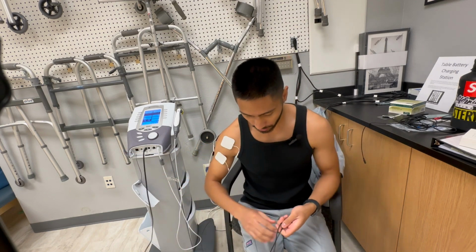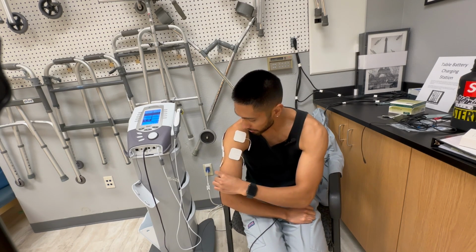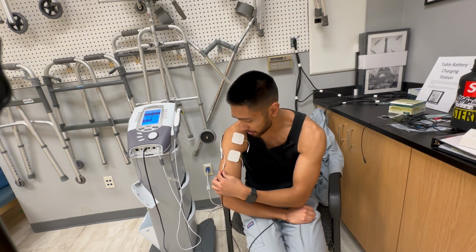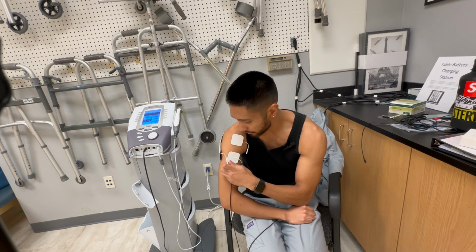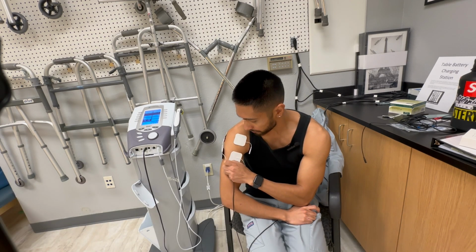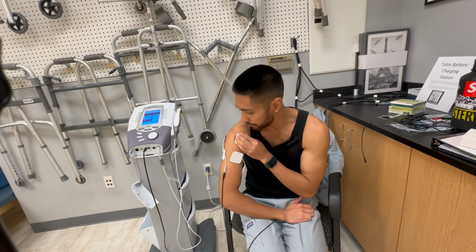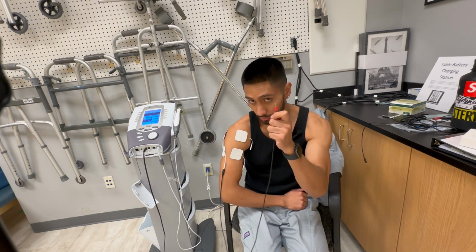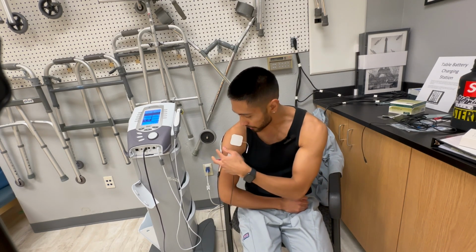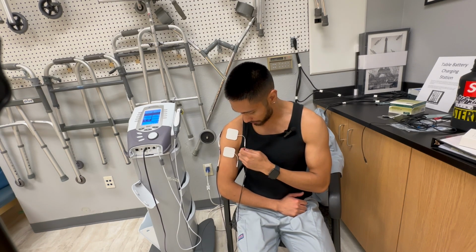So with crossing, let me go ahead and address the hardest one for me. We'll plug it in. It will be right here, the very bottom right pad. Right pad is put on, and then this red one will go directly across, diagonally across for treatment. And this is the first wire, channel 1.